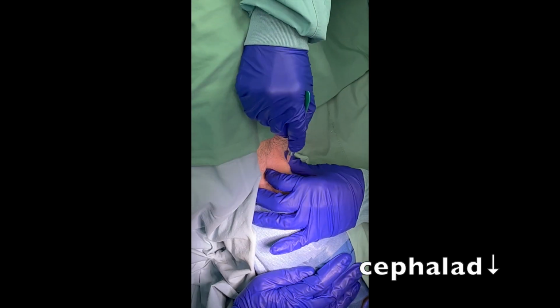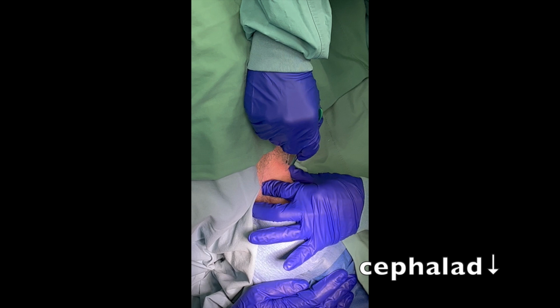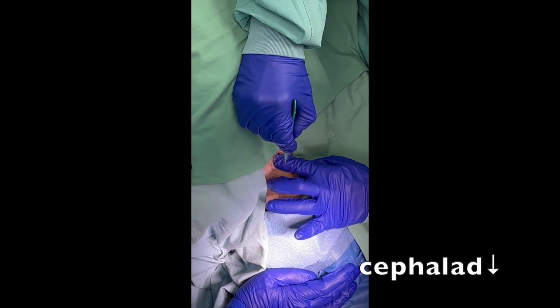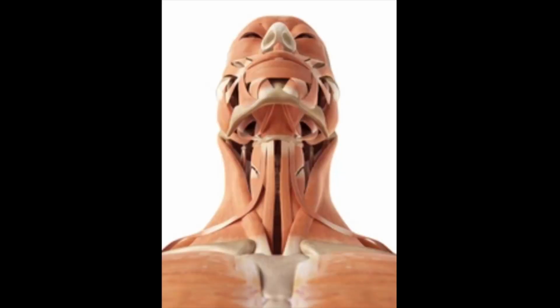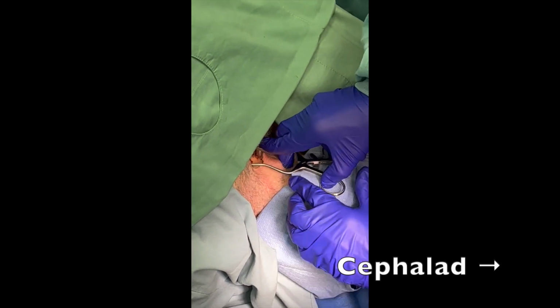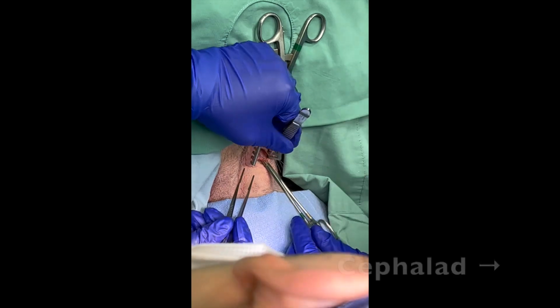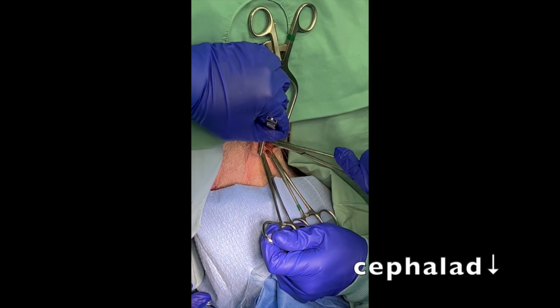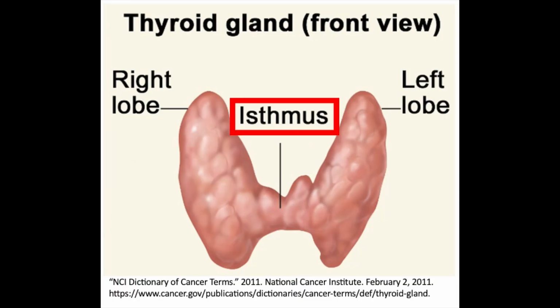Stabilize the trachea with your non-dominant hand and make a midline vertical incision. Not demonstrated in this video, but cautery could also be used. Next, divide the subcutaneous tissues and split the strap muscles. You can insert your retractor. The layer separating you from the trachea is the thyroid. Since it is a well-vascularized organ, it is recommended to clamp it on the midline on either side of the isthmus. Divide it and ligate it.